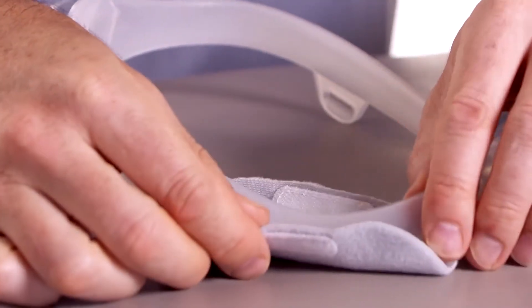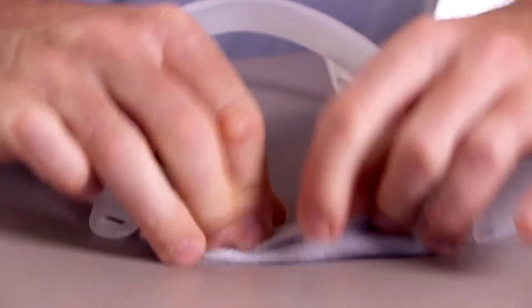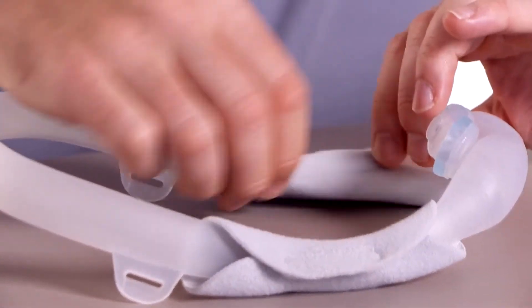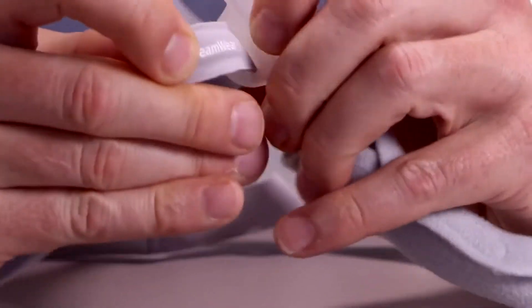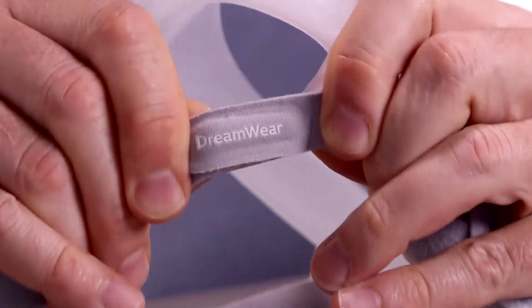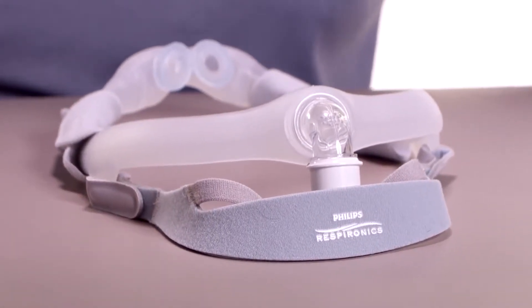Wrap the optional fabric sleeves around the mask frame so that the seams are on the outside, away from your face. Press the strips together to attach the sleeves. Now slide the tabs on the headgear into the slots on the mask frame and fold them backwards. When correctly assembled, the Philips logo will be on the outside, facing up.